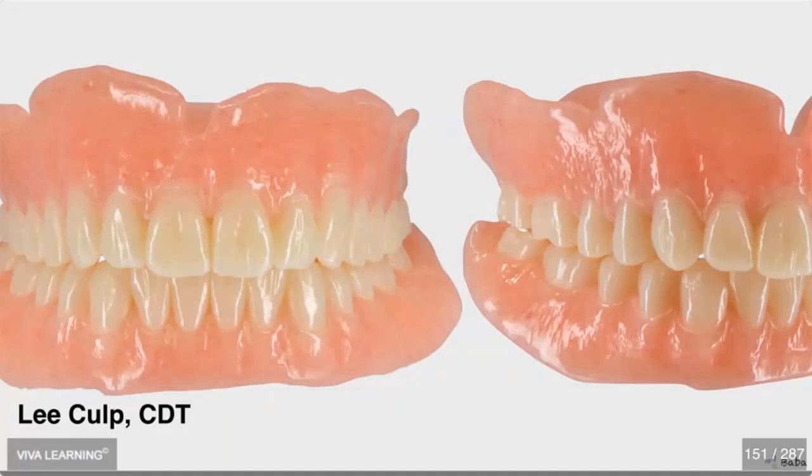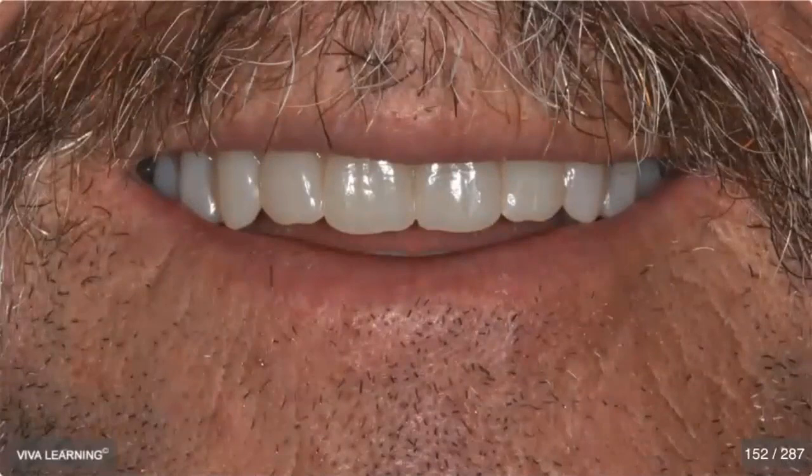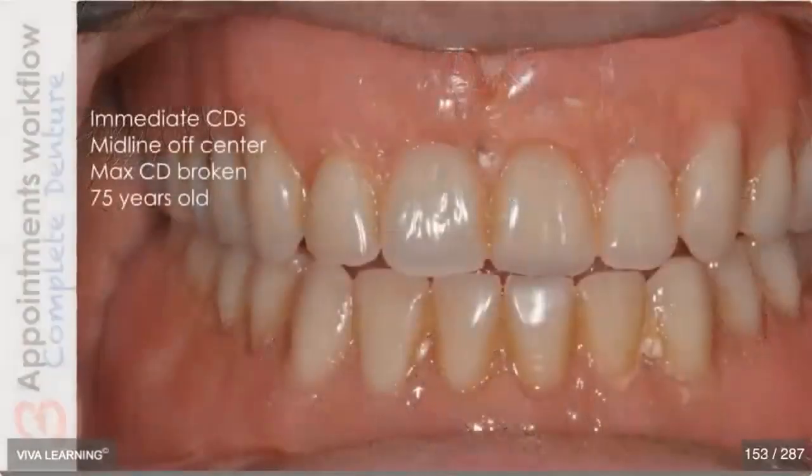So all you have to do is go to the trial appointment and then adjust them, do some traditional PIP just to find out if the bases are fitting properly. And you just check the occlusion. If some adjustments are needed, you can do them.